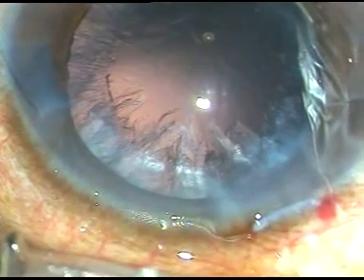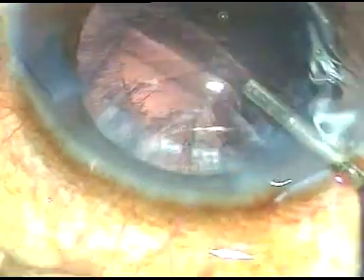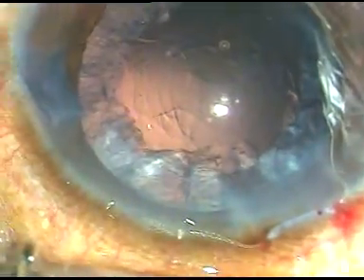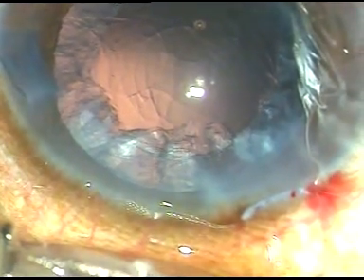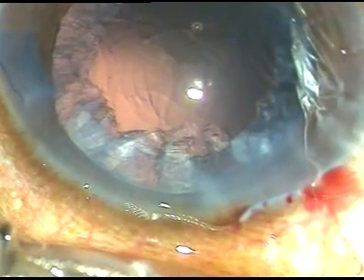Now, this cortical matter is to be cleaned. It can be cleaned in various ways. You can take coaxial IA or bimanual irrigation and aspiration. I take this very simple instrument. It is a Simcoe cannula. It is a 23 gauge Simcoe cannula and it works very well in my hands.